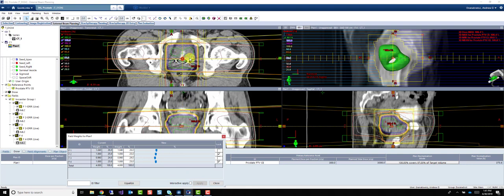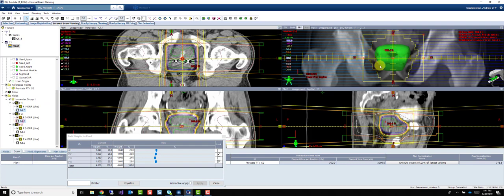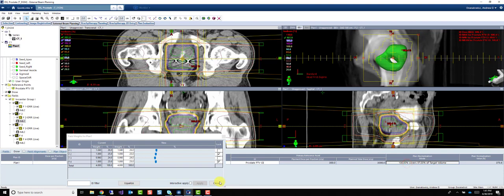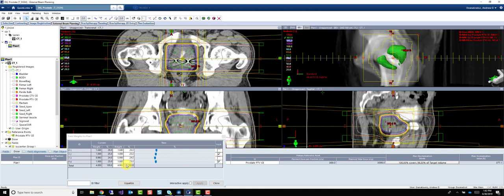Even that out a little bit. Left and right is fairly close. So I just don't feel that we can really use field-in-fields to cool this down. Let's do 96.5. There we go. So now it's starting to break up. So let's try this.